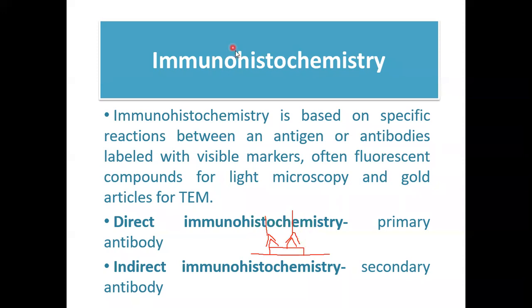Then we will detect the presence of this binding or reaction. This is an antibody-antigen complex, right? So we will detect the presence of this complex by using now another antibody. And that's naman your secondary antibody. Again, your secondary antibodies, they are labeled.